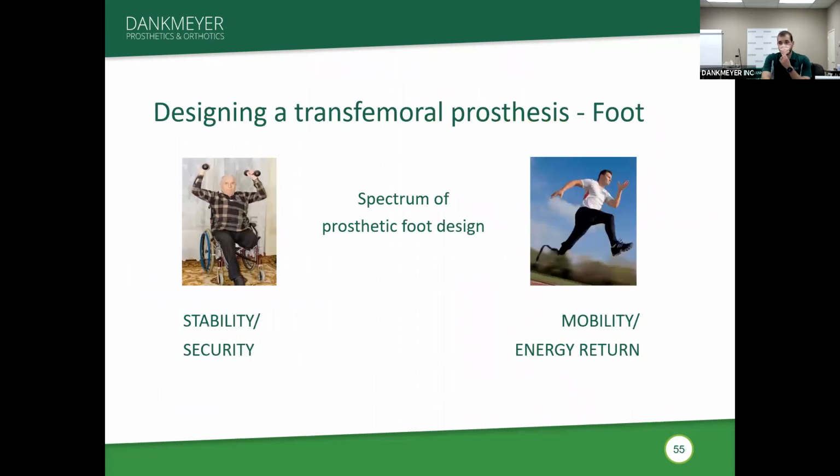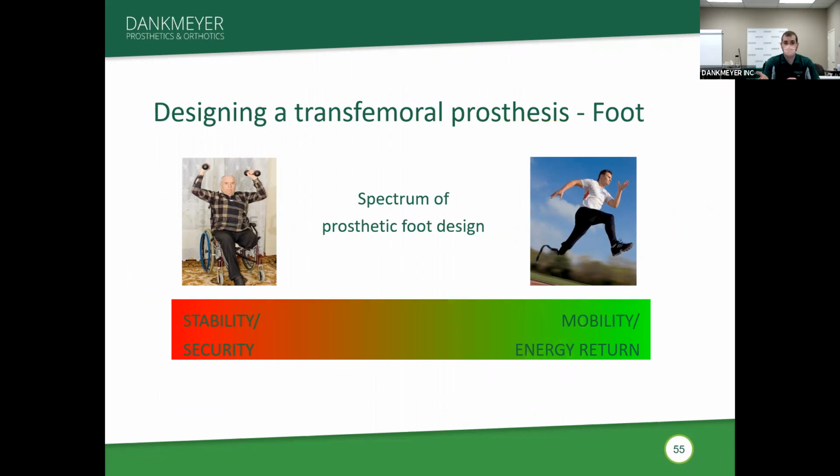All right, moving on to the foot. And again, you still have the same types of things to consider when selecting a foot, right? You have that spectrum of foot design. What are we wanting? Are we wanting mobility and energy return, or are we wanting that stability and security?